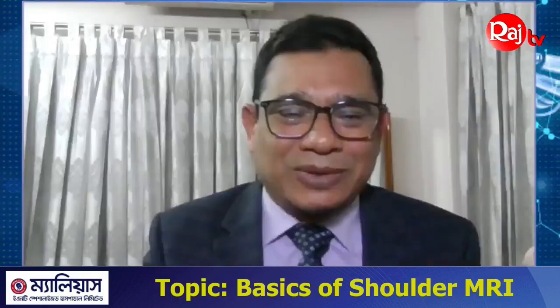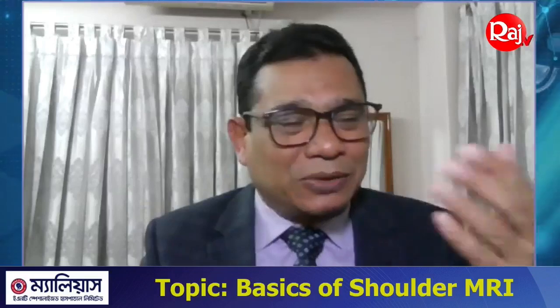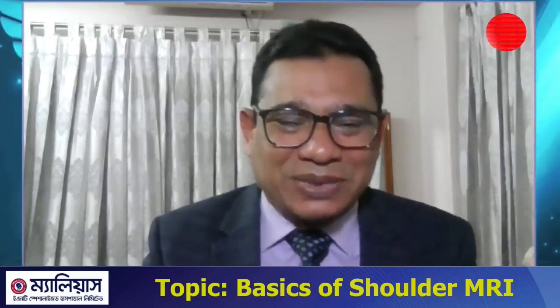Most of the time, if you see the MRI report from the radiologist, most of them say that it is normal. But I have already told that we have an advantage over radiology because we take the history and examine the patient. And when I detect that this patient is suffering from such a type of lesion, we directly find this film, this film, and where the pathology is.